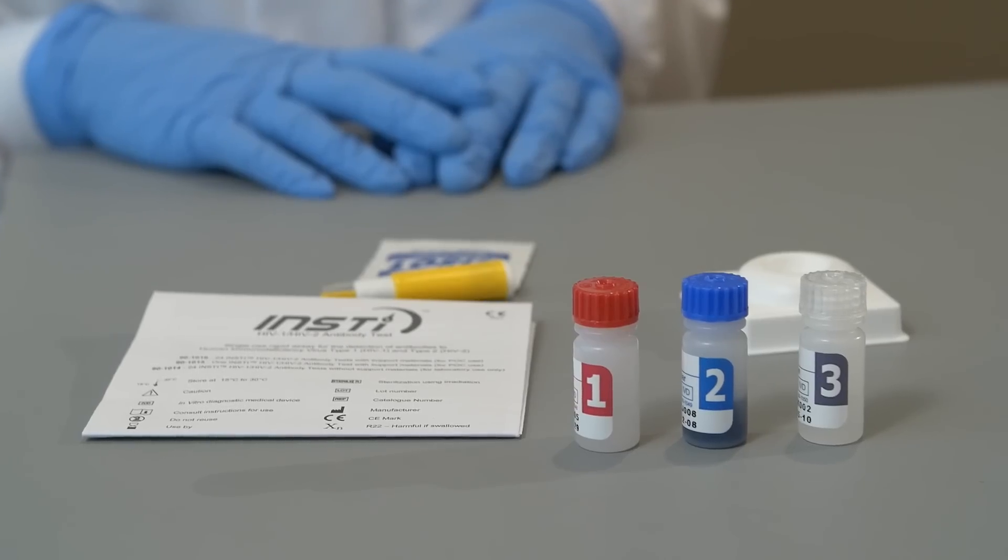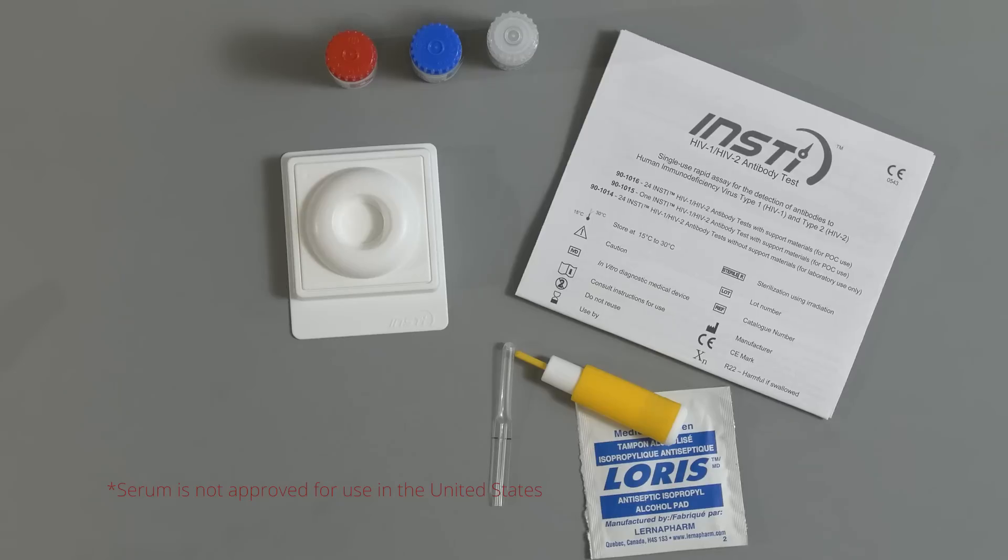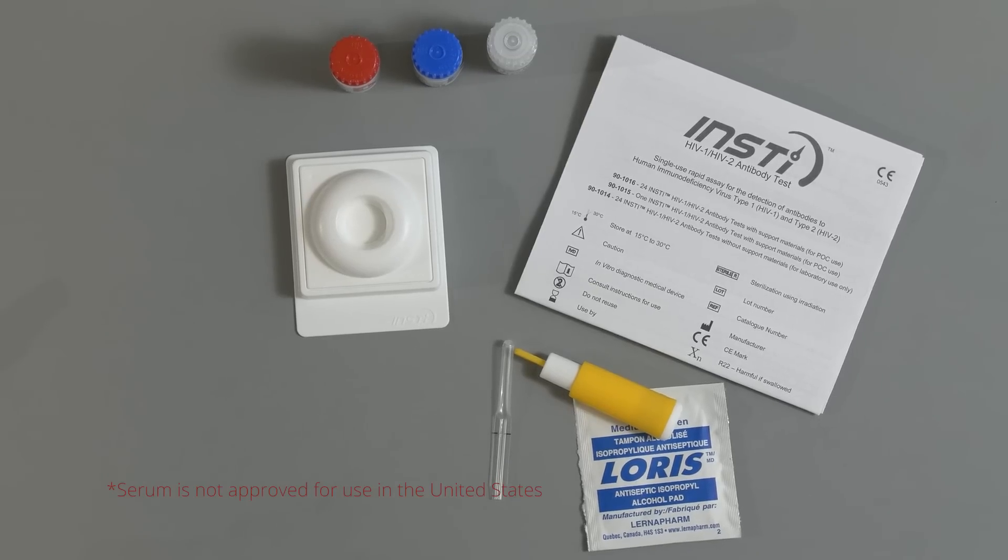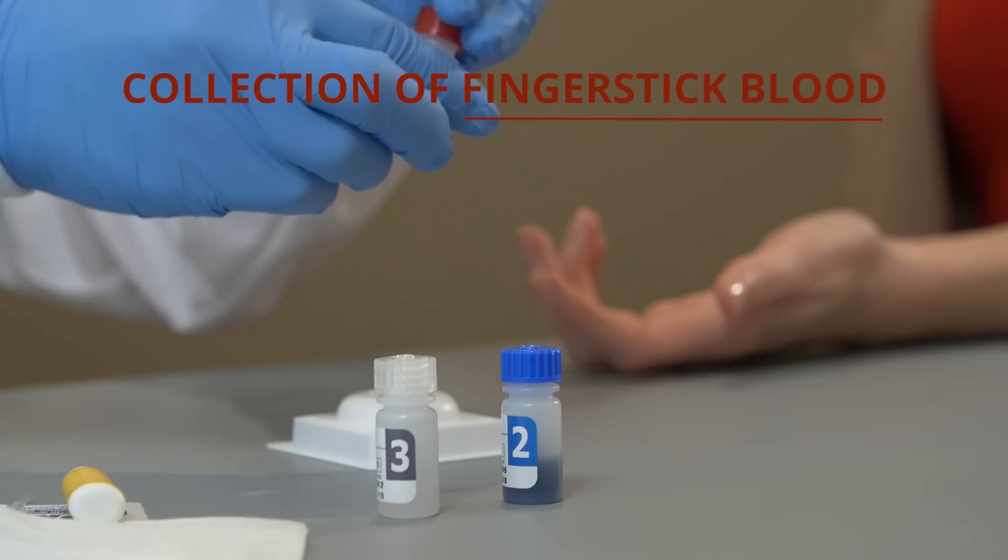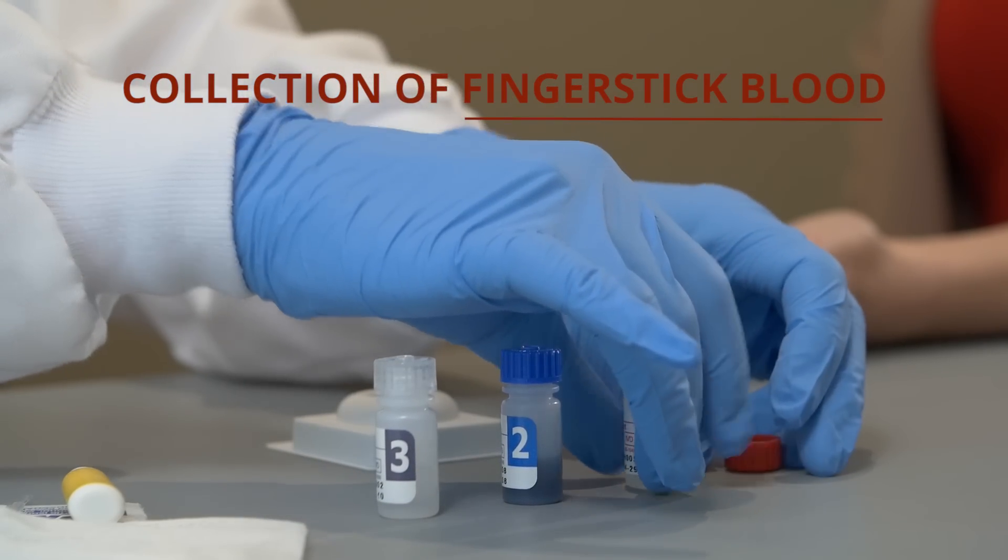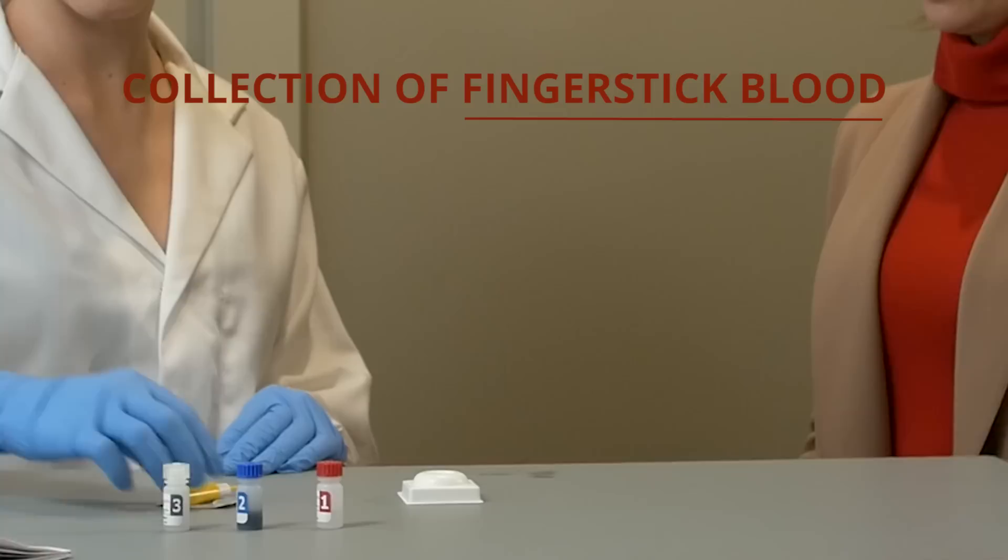INSTi can be used with finger stick blood, venous whole blood, serum specimens, and plasma specimens. First, open bottle number one, the sample diluent, and retain the cap. Do not open bottles two and three at this time.